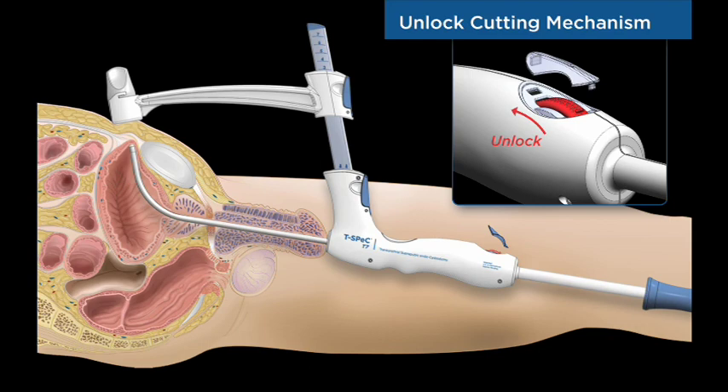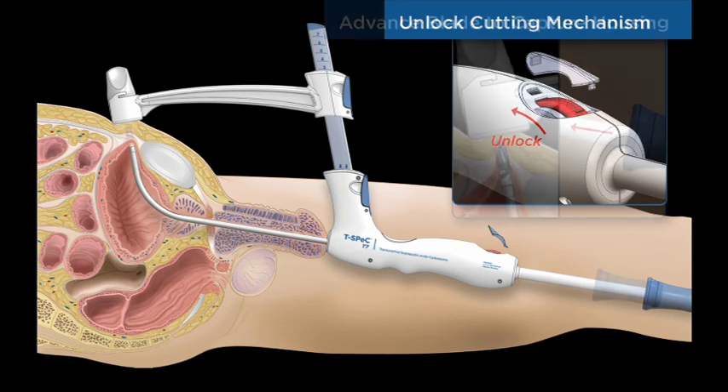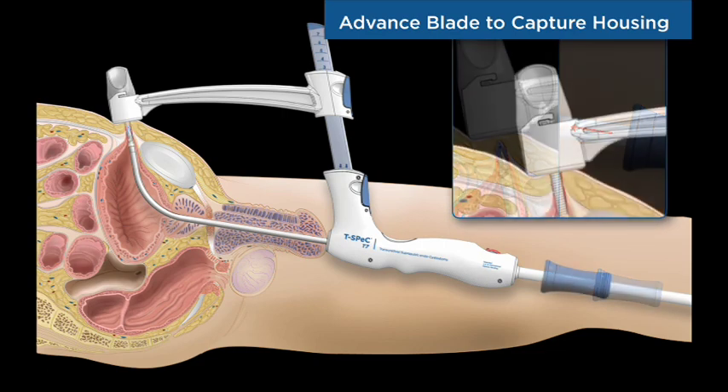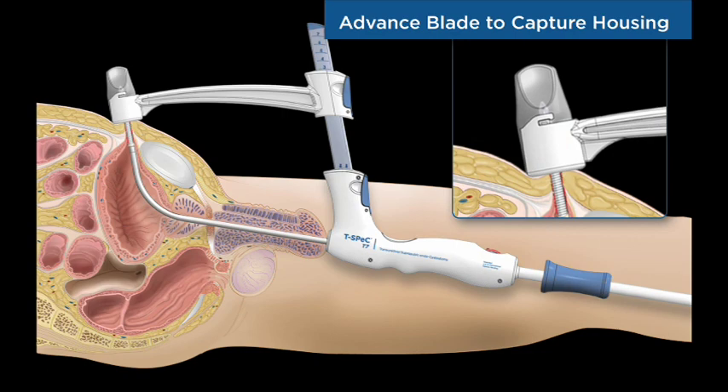Before the physician can advance the cutting blade, the handle and blade mechanism is released by removing the safety cap and rolling the lock to its forward position. The cutting blade is advanced by sliding the rear handle forward. The smooth action of the cutting blade mechanism ensures a precise and relaxed cut from the bladder wall to the abdomen surface.